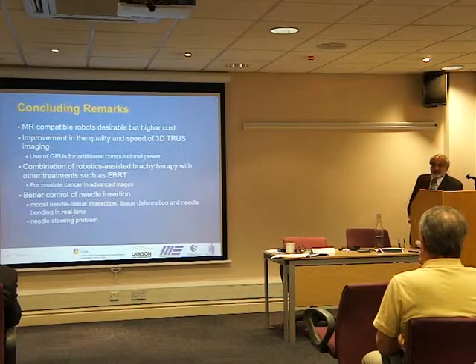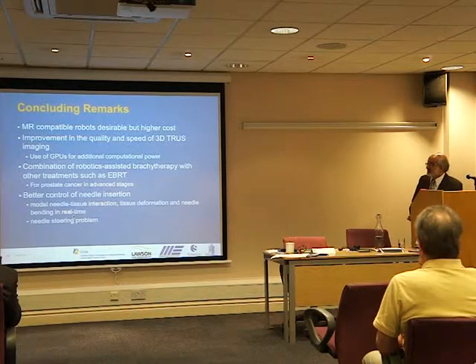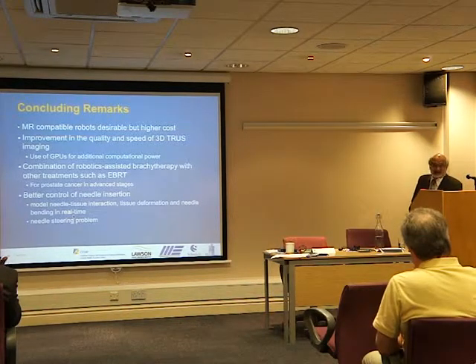So there is a lot of work now being done, primarily by engineers, looking at how to insert flexible needles into deformable tissue, especially nonlinear, viscoelastic, non-homogeneous tissue. And once this is done and implemented, we can expect much higher accuracy for needle insertion, in fact even through ultrasound.